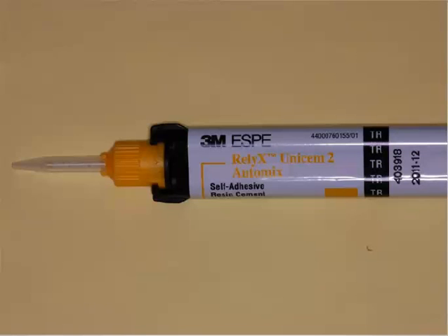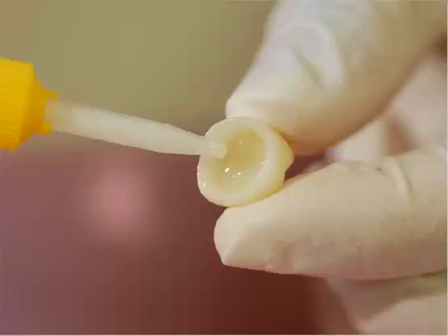It's a methacrylated phosphoric ester and glass fillers, and allows a conventional set of 5 minutes, or you can also light cure it, which really has some benefits. We use this for posts, we use this for everything, and it really is a workhorse. It has 4 or 5 different shades. There's many competitors that offer something of that type of description.